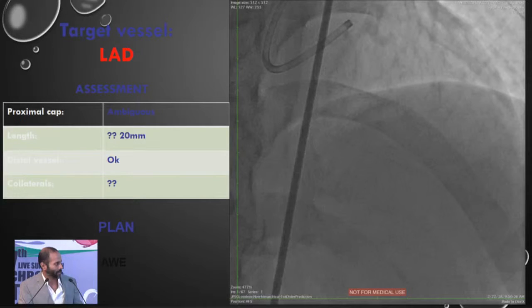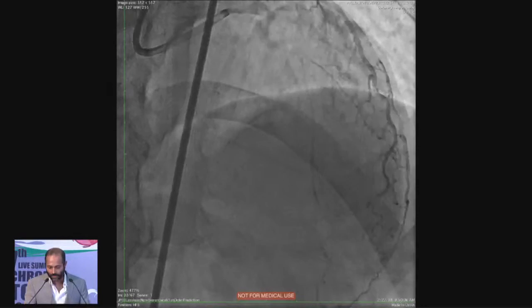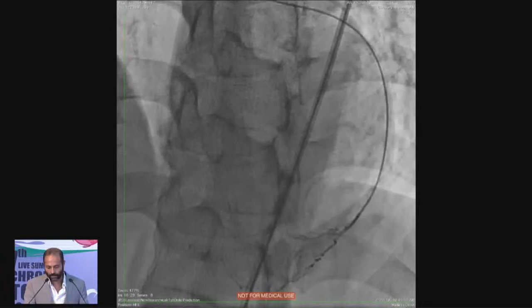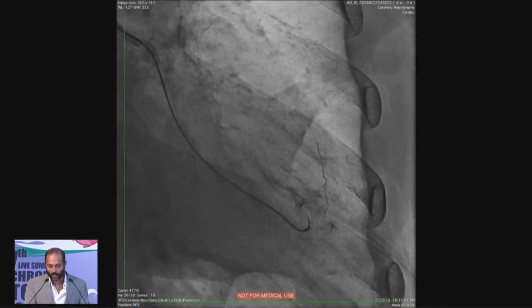I'm sorry about the color. If that didn't work, IVUS-guided antegrade wire escalation. If that didn't work, ADR. And so that's kind of what we're dealing with. There were no contralateral collaterals. So they tried to wire this collateral first, unsuccessfully, then one from the OM, didn't work.